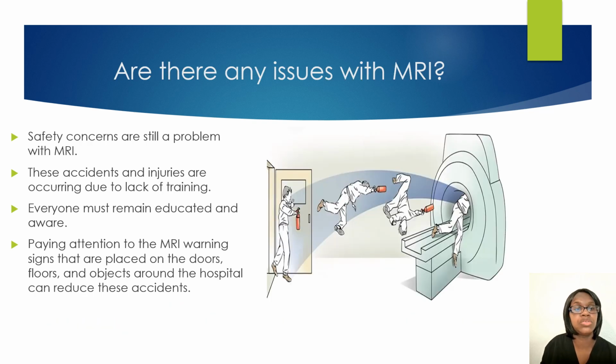Are there any issues with MRI? Safety concerns are still a problem, even with me recording this video in 2024. There have been about 3 or 4 accidents between June and September. I'm recording this in October. It's just too many to keep adding to the presentation. It's delaying me from putting this presentation out.